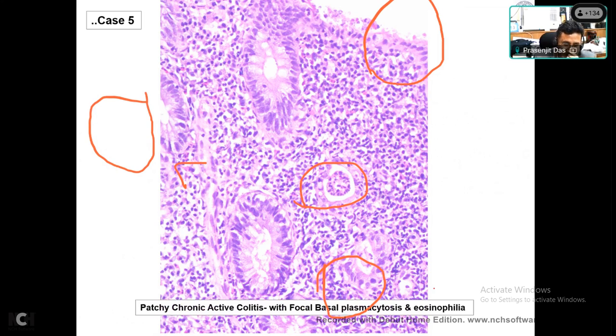It is a patchy disease, and all of you know the patchy lesions can be seen in Crohn's disease. So can you just jump and make a diagnosis of Crohn's disease in this case? Or do you consider any other differential diagnosis?